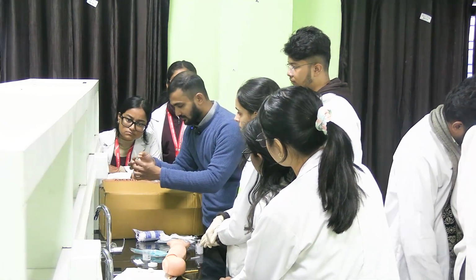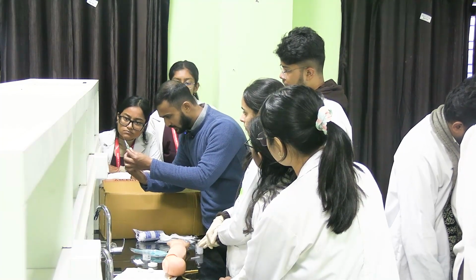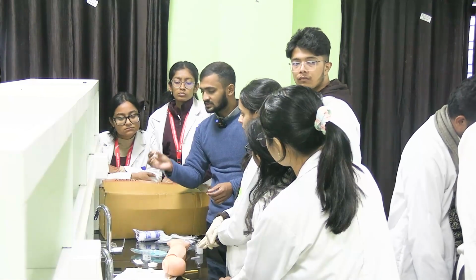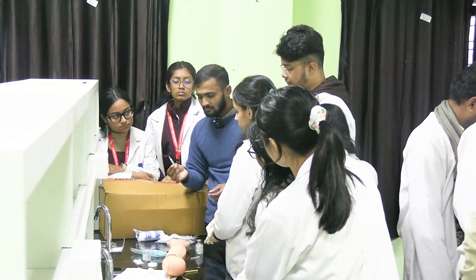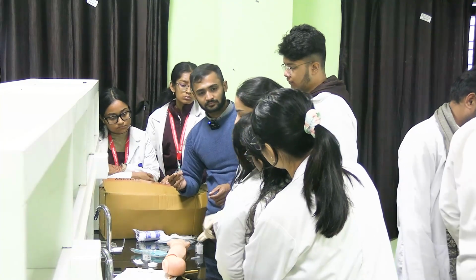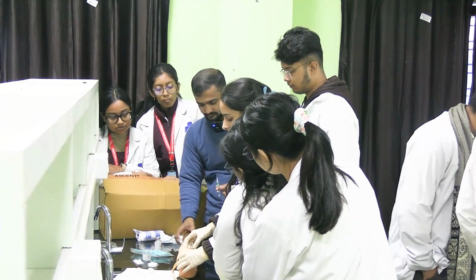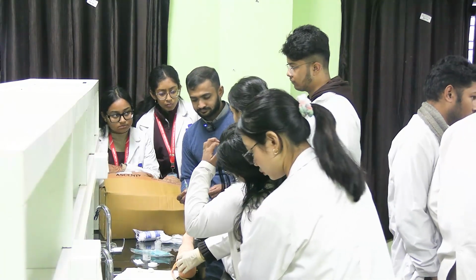Now remove the bubbles or air trapped and correct your marking. Okay, now this way it is prepared. Now this is ready to be injected. Okay, now what is the next step? Sterilize. So you have already sterilized. Currently, right? Sterilize. So we'll inject.